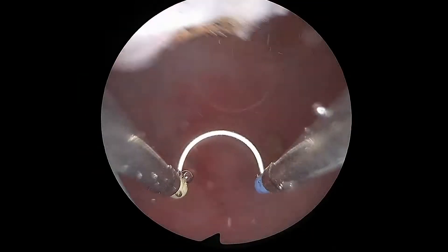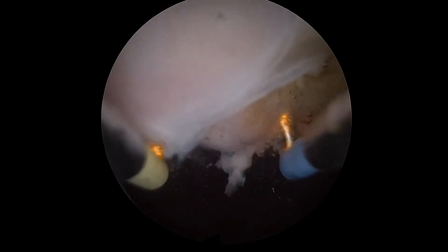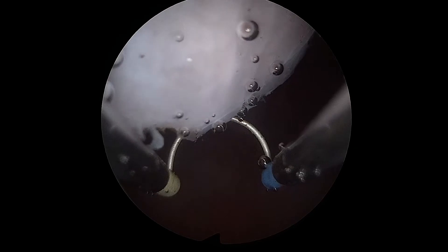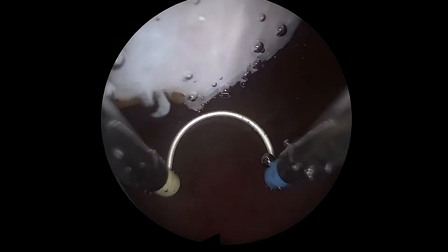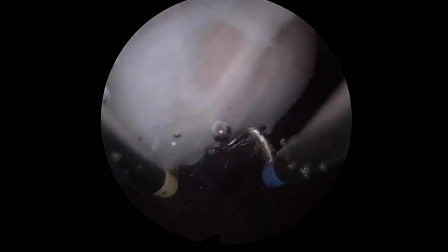This highest fidelity real tissue model hysteroscopic myomectomy simulation provides outstanding face validity and a level of haptics not achieved except in real procedures.